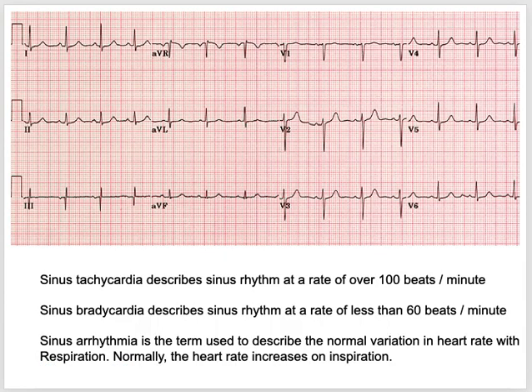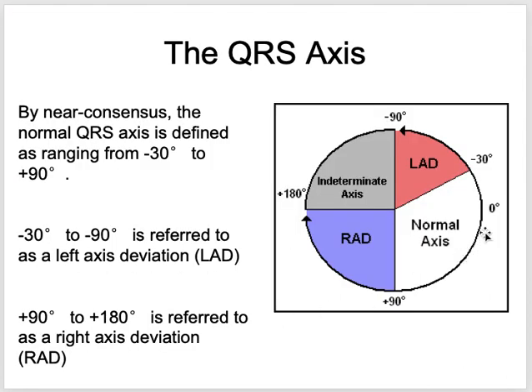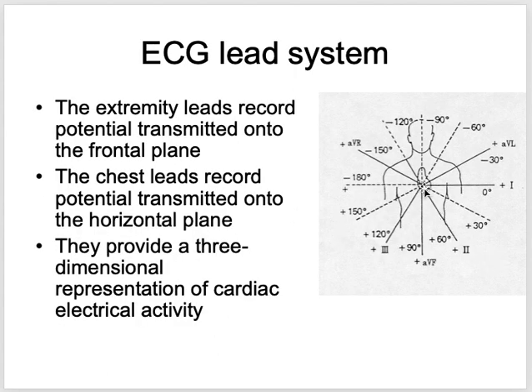So a very easy way, guys, to remember this: in right axis deviation, lead 1 will be downgoing. And in left axis deviation, the final vector is deviated towards this side, and the axis shifts anti-clockwise. Normal is this one; in left axis deviation it has shifted here, which means either lead 2 or lead 3 is giving a negative vector, or showing opposite results or opposite direction.